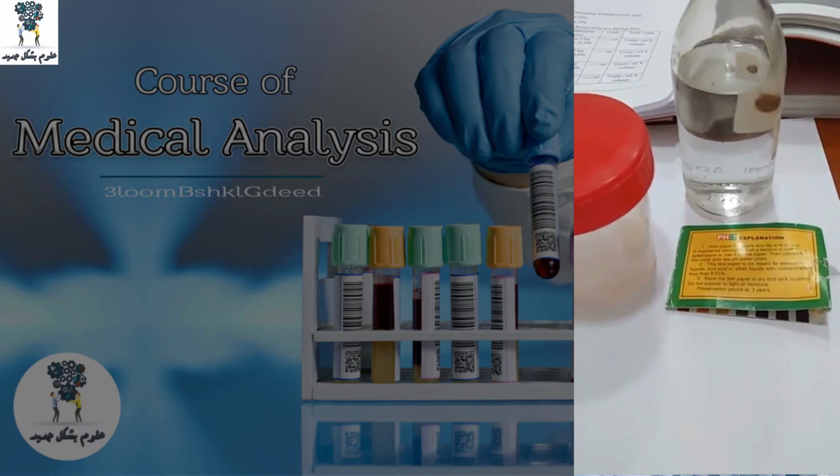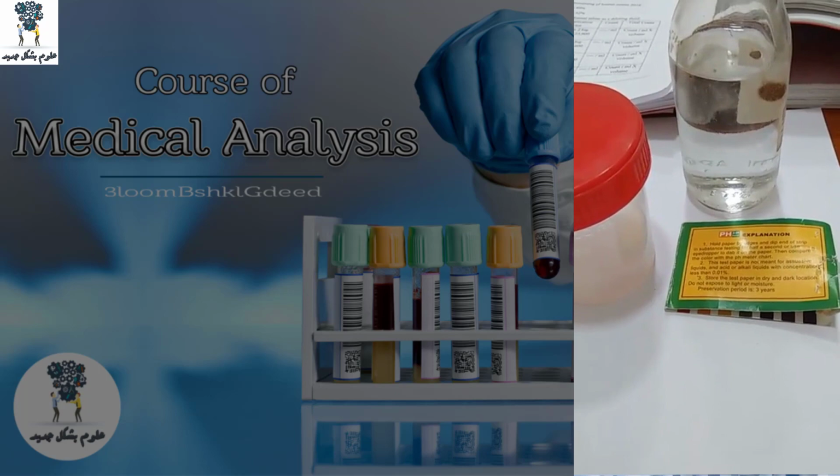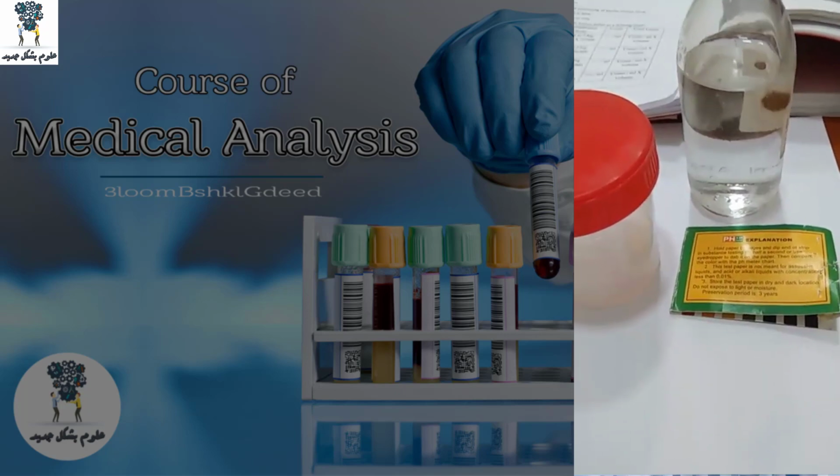So at this point we have a vitality test if there is motility less than 30%.